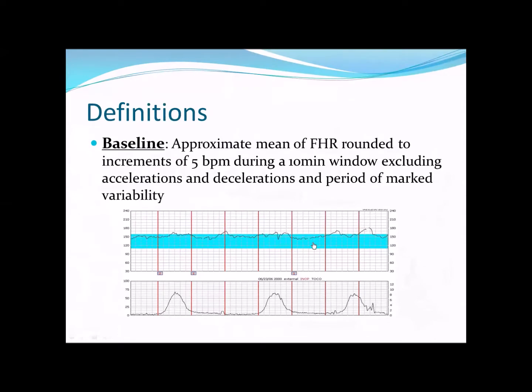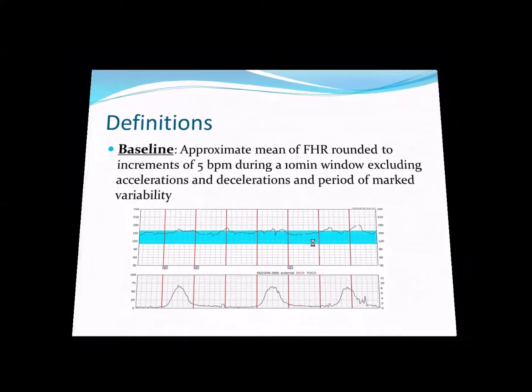150. Yep, 150 to 140. Honestly, a doctor's not going to stress if you put 145. Sometimes the nurses will average it. If we're going between the two, they'll say 145. So that's good. There's not a wrong answer. If you would have told me 110, we might have had to have a talk after class. But no, it's fine.